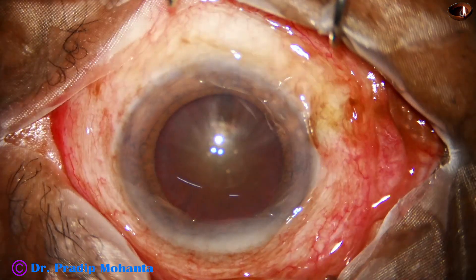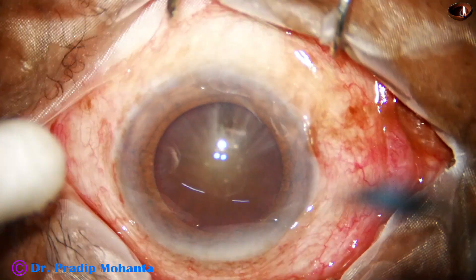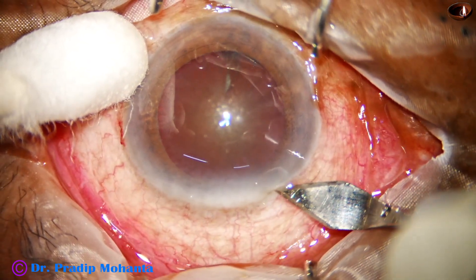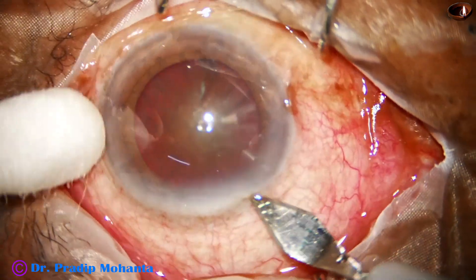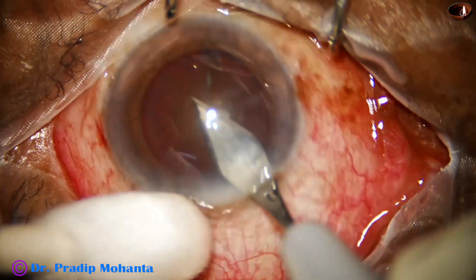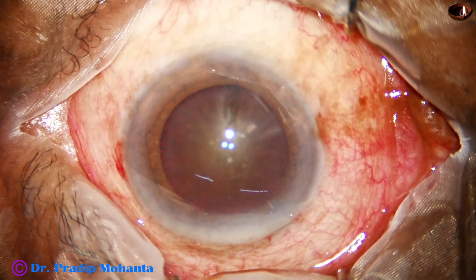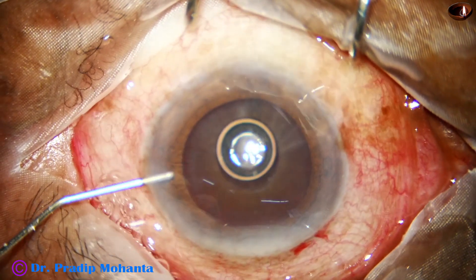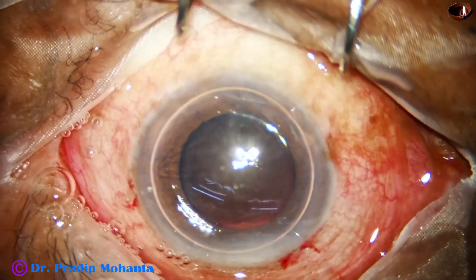This is a sideport at around 2 o'clock and now this is a main incision at around 11 o'clock. The main wound is 2.8 millimeter on the posterior aspect of the limbus, and now an air bubble is injected.